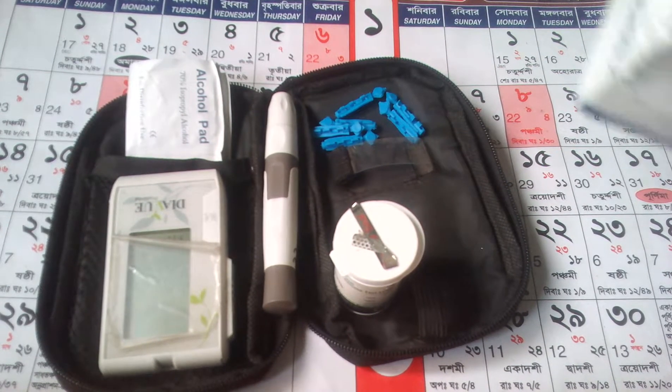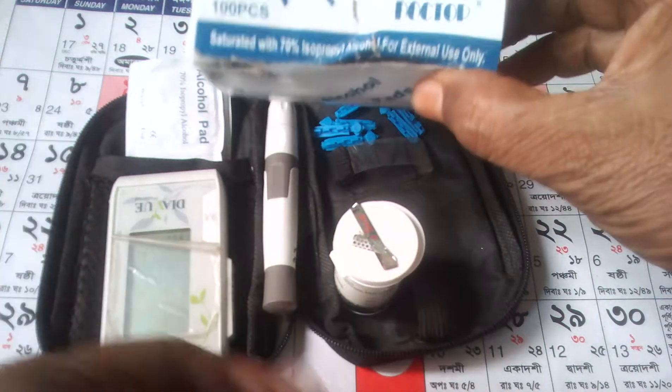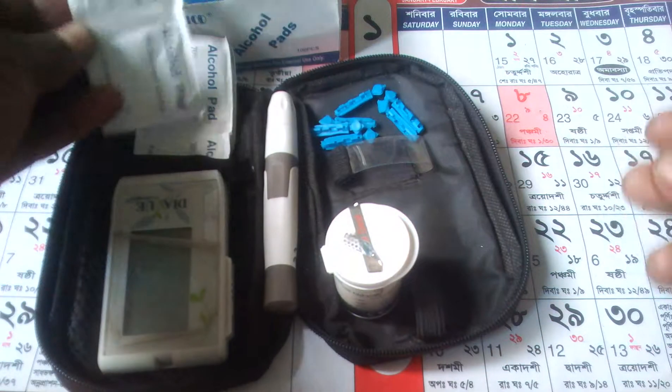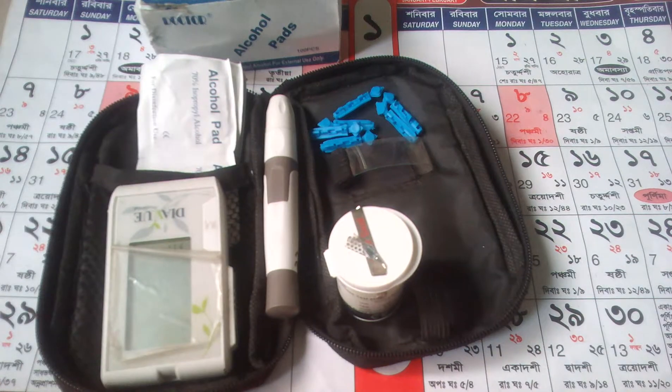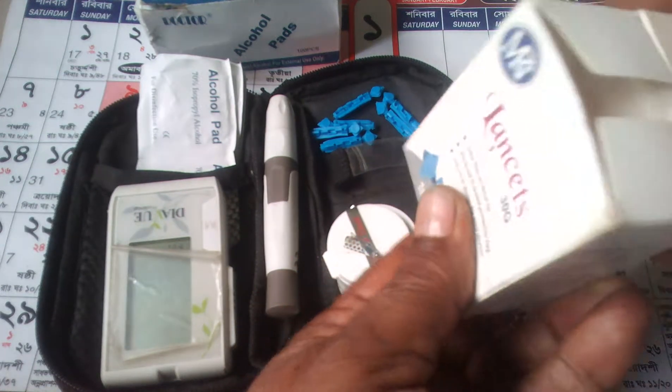First, needed: alcohol pad — alcohol pad is an alcohol pad — needle or lancet.